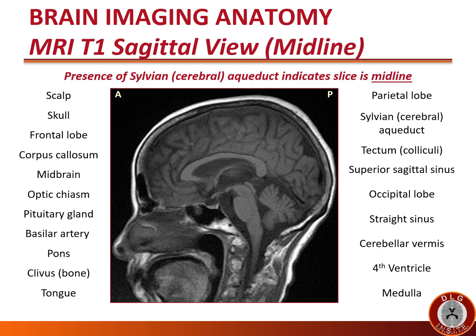To further our perspective of brain imaging anatomy, we are now going to review an MRI T1 sagittal view in the midline. The sylvian aqueduct is in the midline and is as thin as a pencil lead, so its presence on a sagittal MRI indicates the slice is midline. As we go through the anatomic structures listed on this slide, we will eventually get to the sylvian or cerebral aqueduct. Pause and see if you can identify the structures listed before proceeding.